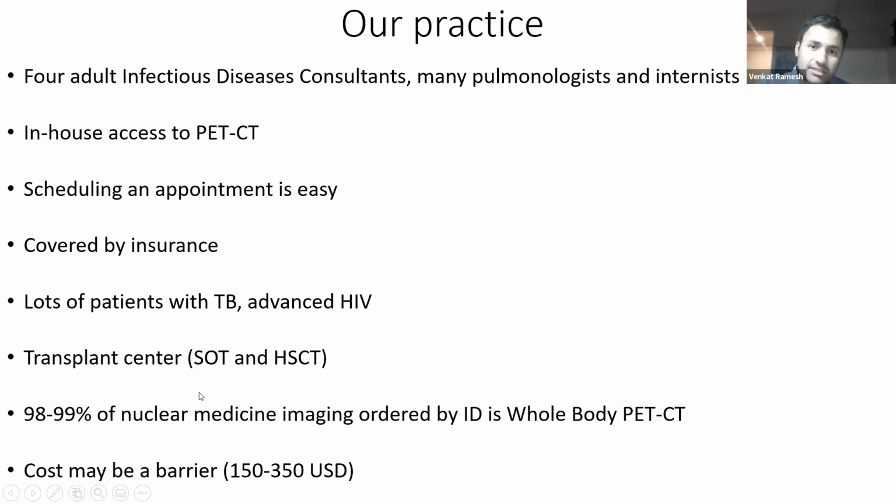Most of our consults are for fevers of unknown origin, and most of what we order is whole body PET-CT with FDG. One barrier to whole body PET-CT in the city is the high cost. Depending on the center, it can vary from the equivalent of 150 to 350 US dollars.